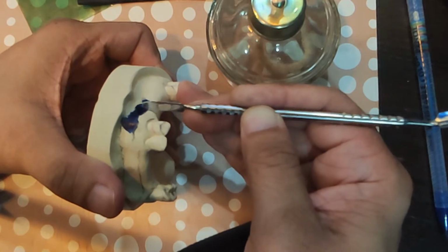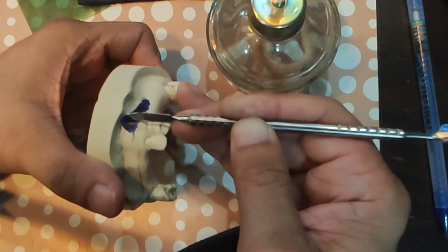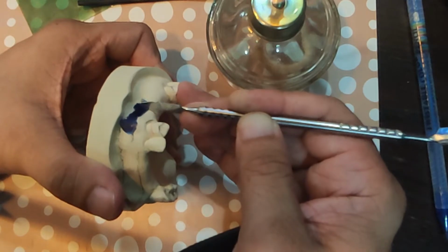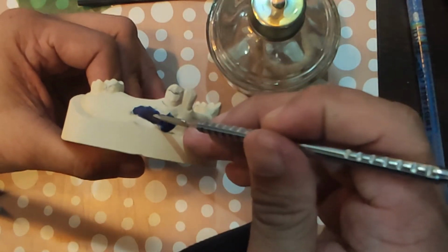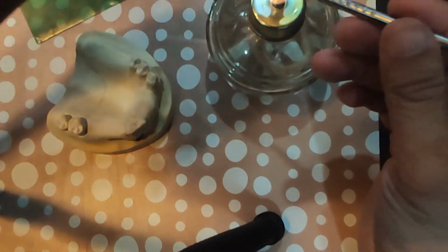Normally, ideally, we do the wax removal of the tissue undercut, or the tissue block, the parallel blockout, on a surveyor. Sana. We don't have one, so we make do with what we have. Medyo napadami yung pagbawas.